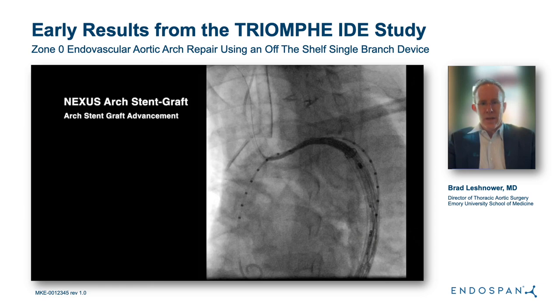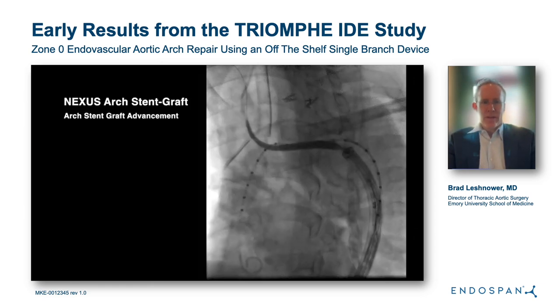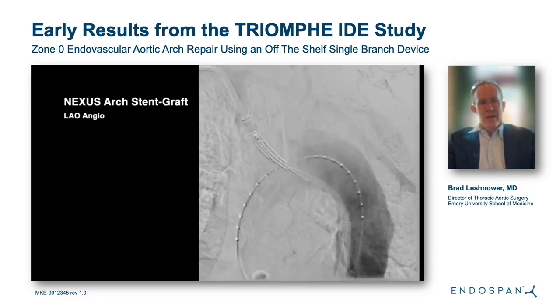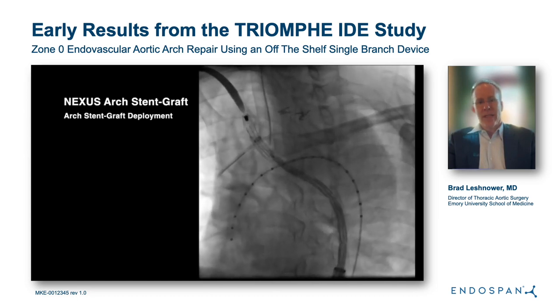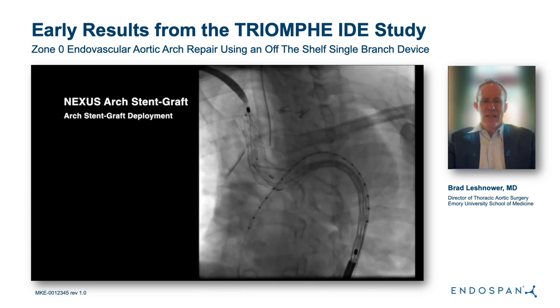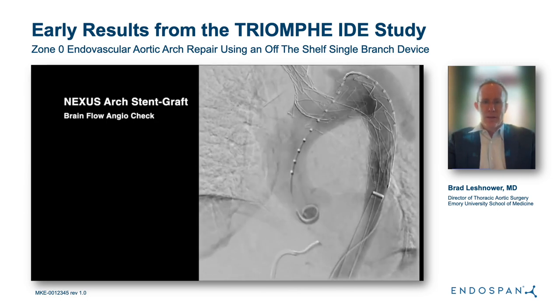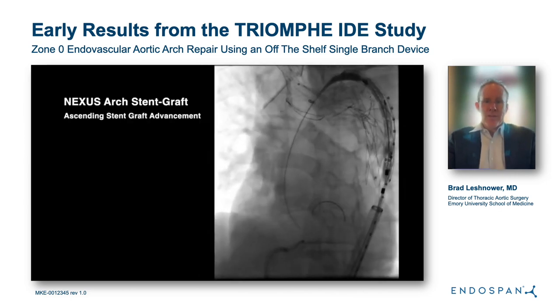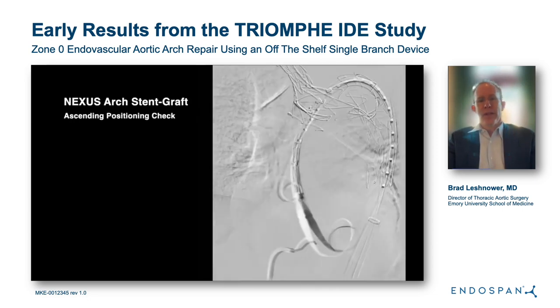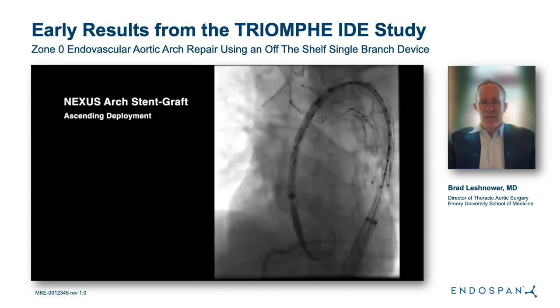Now I'll take you through the fluoroscopy and aortograms of the case. The device is advanced through a brachiofemoral wire, and we shoot an aortogram to confirm appropriate positioning. The branch is deployed, and then a short burst of rapid ventricular pacing is used to push the dock into position in the distal ascending aorta. Once the dock is open, cerebral perfusion is established and we can take our time deploying the remainder of the arch stent graft. An aortogram is obtained showing the branches being perfused. Next, the ascending aortic piece is advanced and positioned within the dock to achieve the fixation previously described.